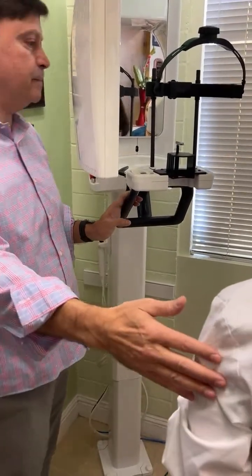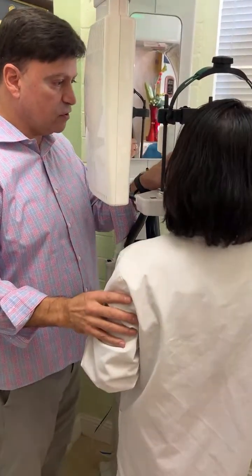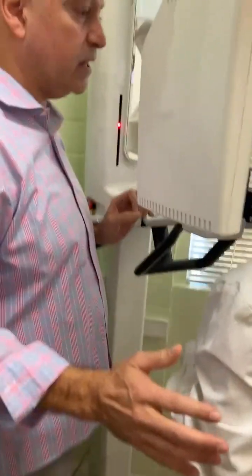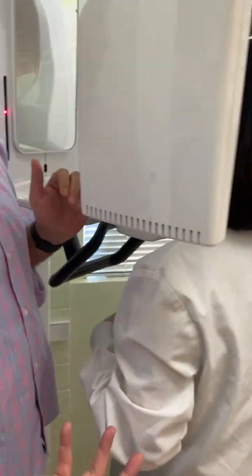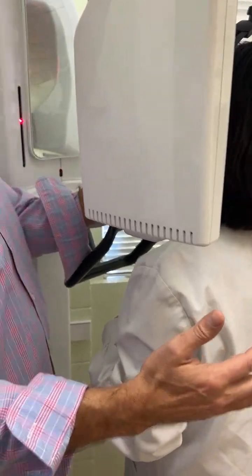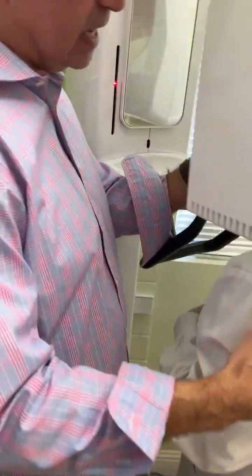Okay, come on in. So this is too tall for you, so we want to stretch you up nice and tall when you get in the machine. The last thing you want is a patient to come in slouching. You want to eyeball how tall they are, and then this is adjustable. So bite on that stick until eight and nine. Open your smile. Your two big teeth are right in the middle of that laser light for me.